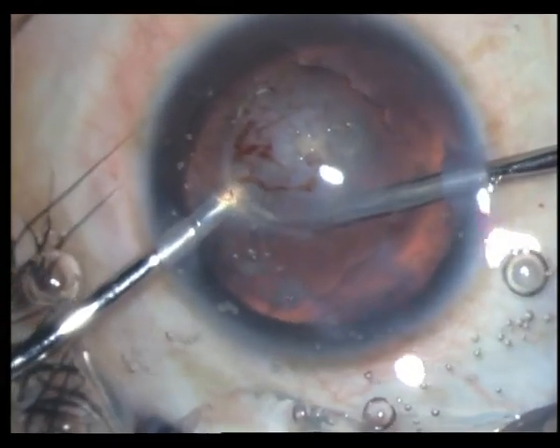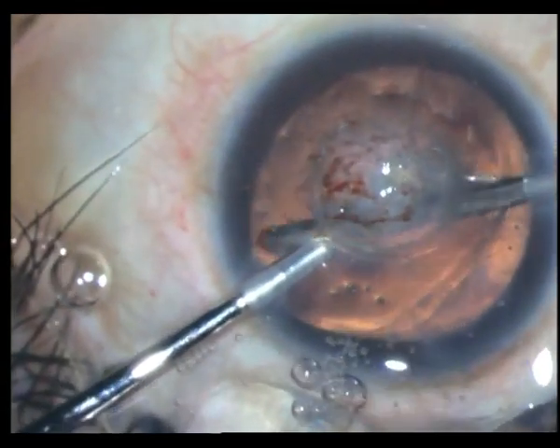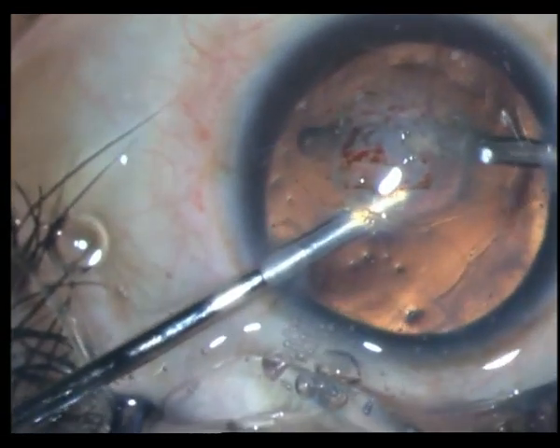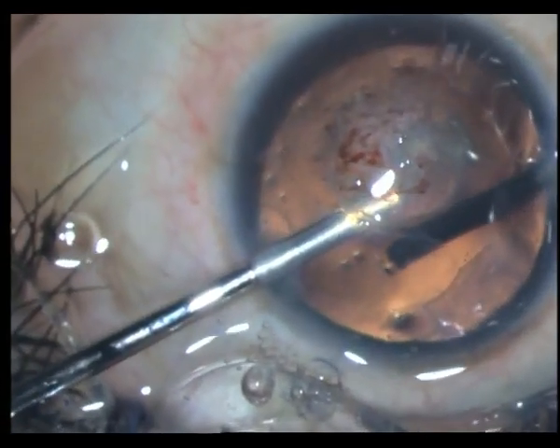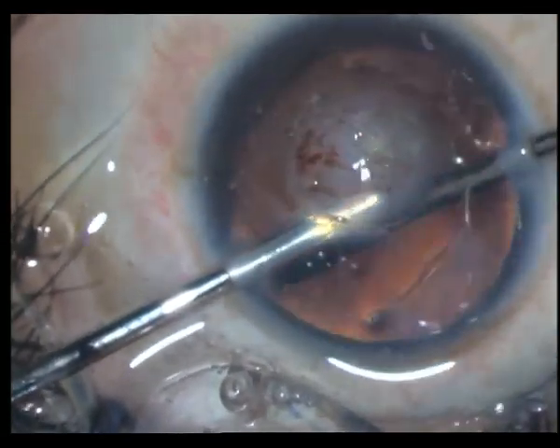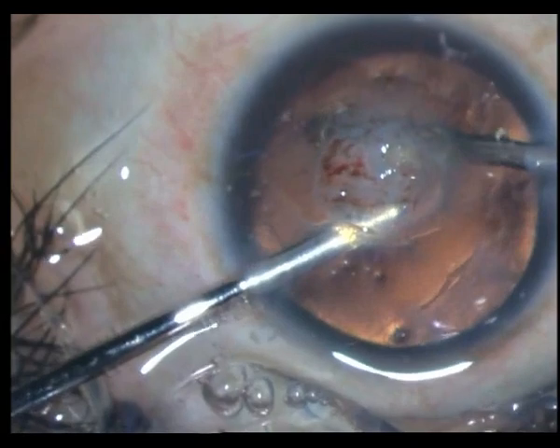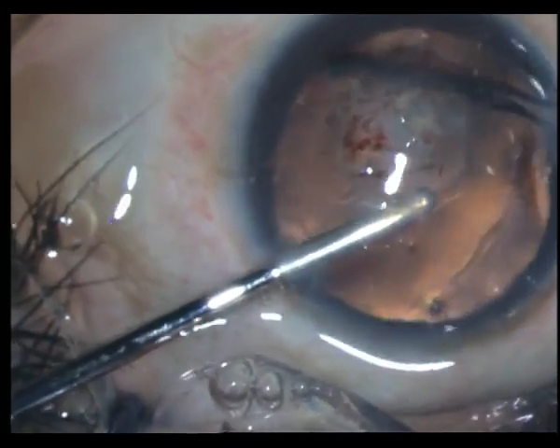Now it's much easier once the nucleus is out — you can go with your bimanual. In the periphery you can see everything, so you can happily aspirate the peripheral cortex. There is not much cortex, as you know — this was a hypermature cataract so most of it was liquid anyway. There are a few fibers in the periphery which I don't want to leave; clean as much as possible. Obviously, if the posterior capsule thickens, you're not going to be able to do a YAG either.